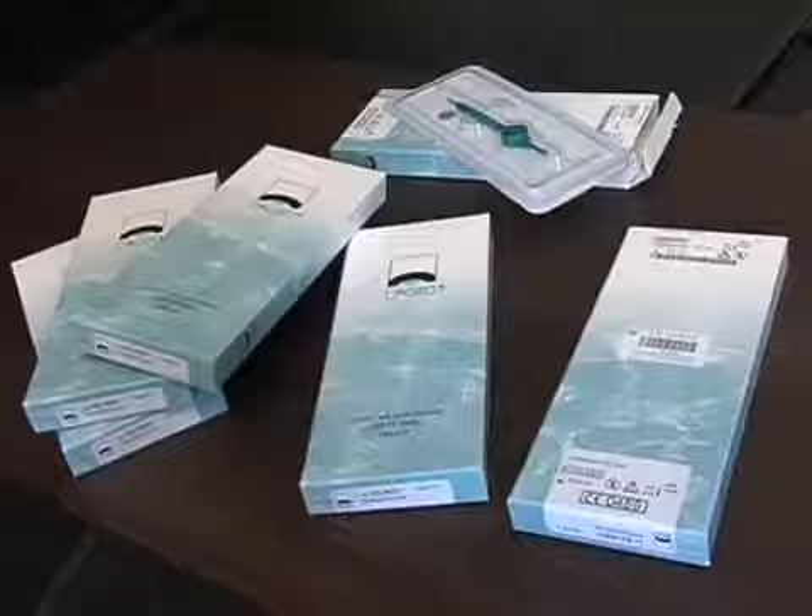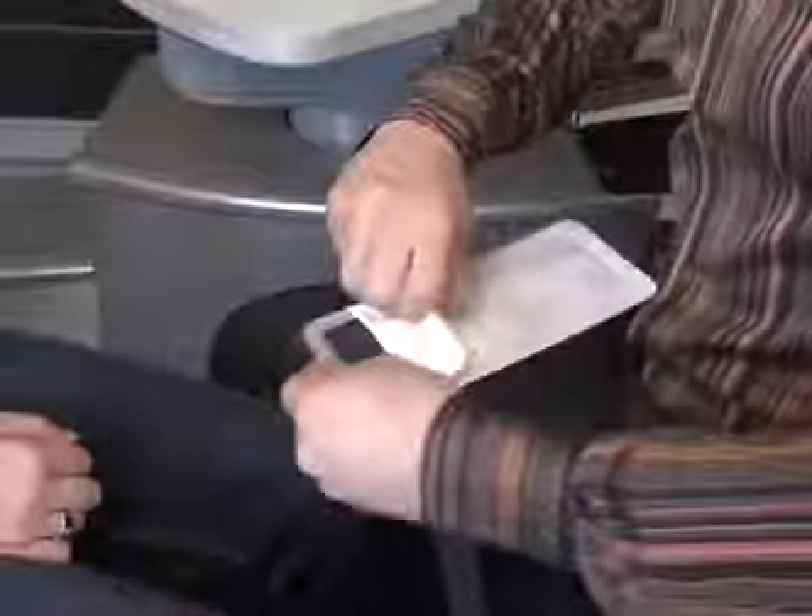Consequently, there is only one part reference number. The painless plug is more economical. It saves time because it is easy to use and quick to fit. The single size of plug eliminates size selection errors, and no plugs are wasted by choosing the wrong size.